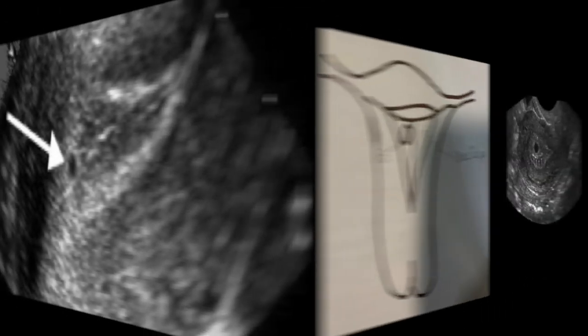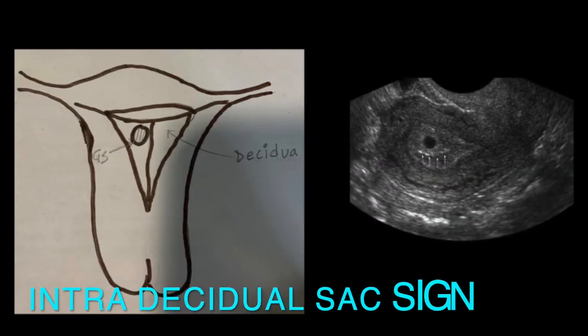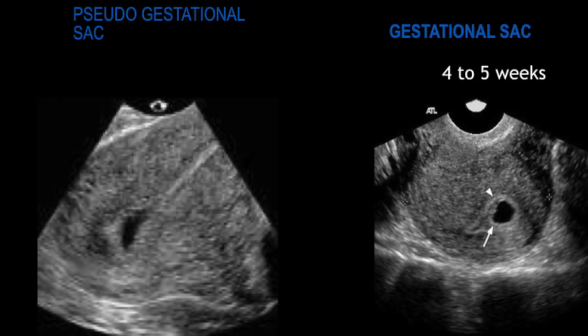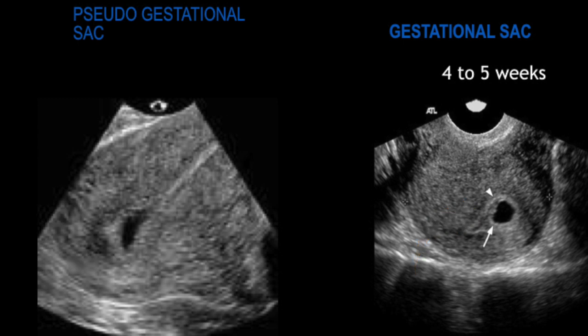This is described as the intra-decidual sac sign, which helps us distinguish between a simple fluid collection also labeled as a pseudo-gestational sac. As you can see on the left, a pseudo-gestational sac is more of an oval or oblong collection right in the center, and you don't see the collapsed uterine cavity, whereas a gestational sac is more eccentrically placed and you can see the central white line which is the collapsed uterine cavity.